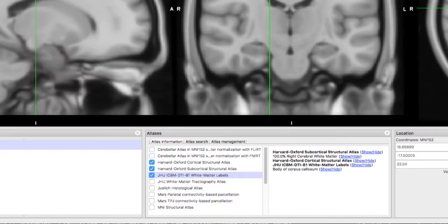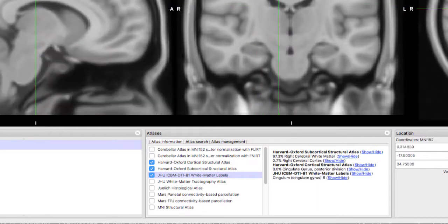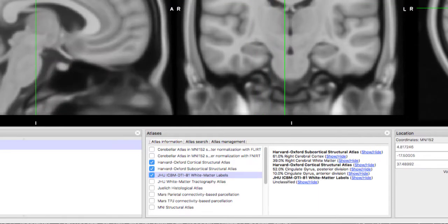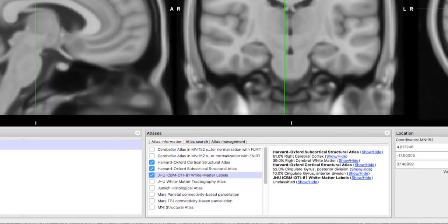Remember that some atlases are probabilistic, meaning that they give you the probability that a voxel belongs to one structure or another. Other atlases are label atlases, which are exclusive. Each voxel is labeled as belonging to one region only.